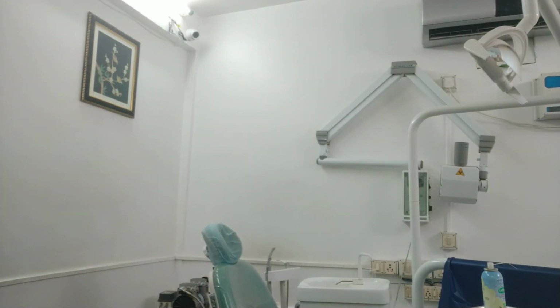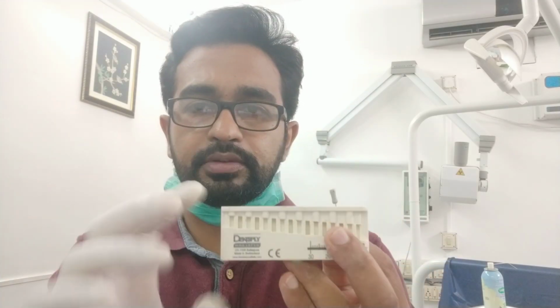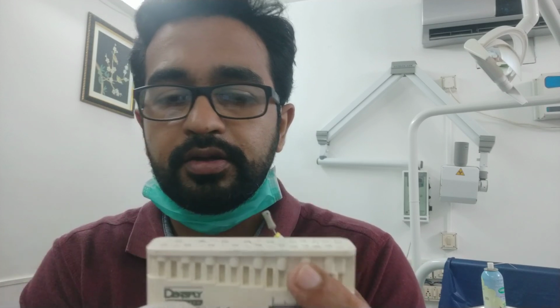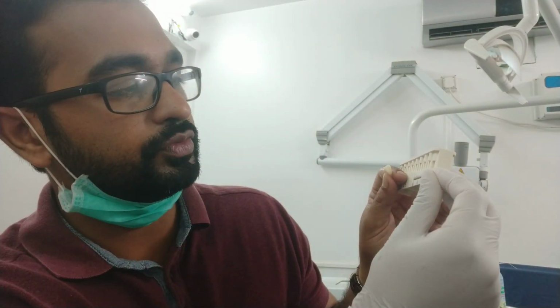So with what we will measure the working length, I have already shown. You have to take this endo block, which is of Dentsply. The company name is Dentsply. So what does it do? There are measurements written on this and also on the sides, right? So you can make the measurement like this. Whatever is the length of this tooth, you can measure it, and then you can proceed with the next file after doing some filing.